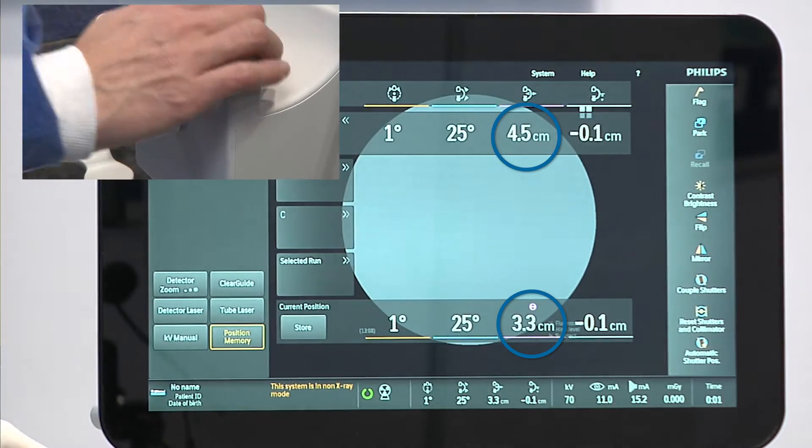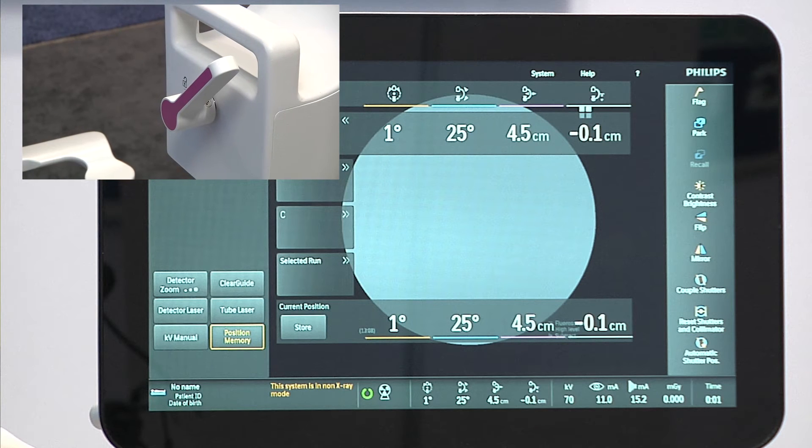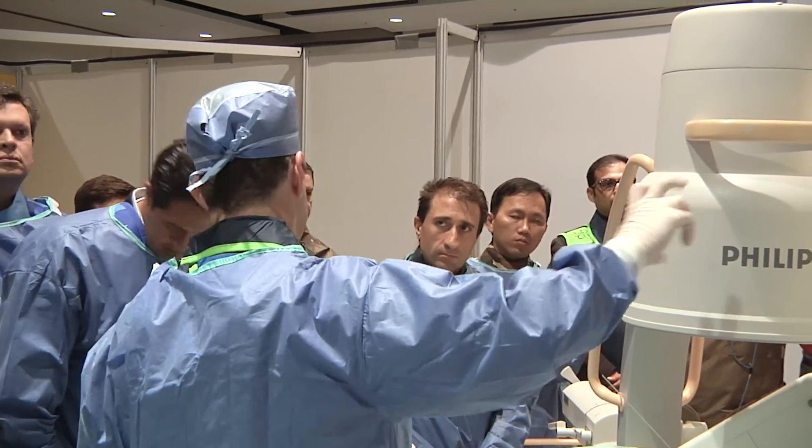Position memory — that is a lifesaver for me, especially if you're in a very intricate procedure. Being able to go back to exactly where the surgeon wants it to be really helps tremendously. The Viradius C-arm is not only a very intuitive operating system with touchscreen capability, but the color-coded simplicity makes it so much easier to operate and to communicate. On the surgeon side, he can point to exactly where he needs it to be and it goes there smoothly and efficiently. Whoever thought of this system — kudos to them for bringing this to the medical community.